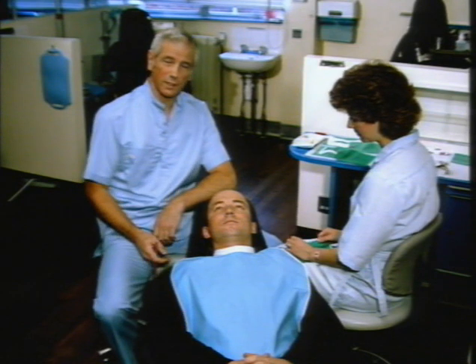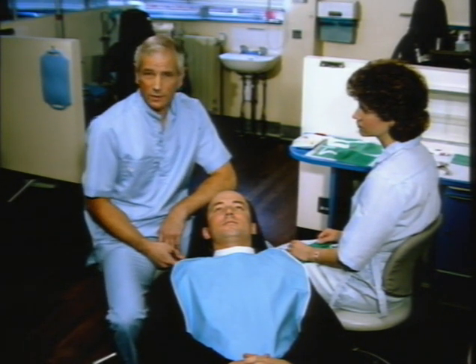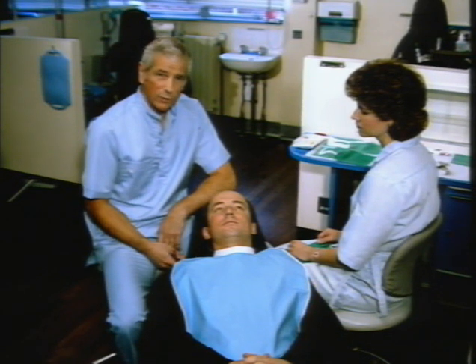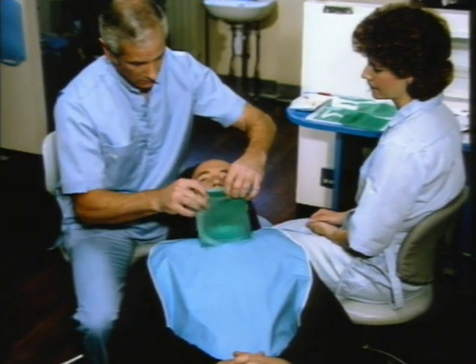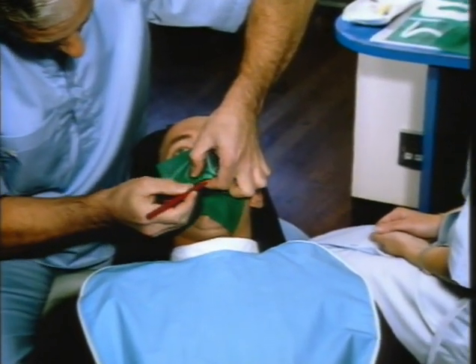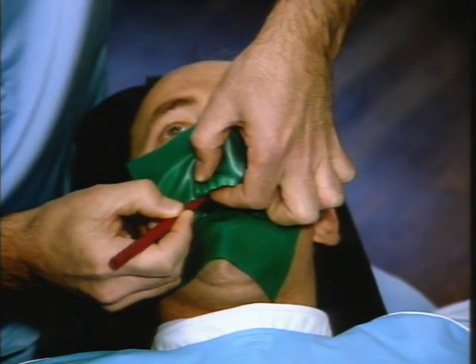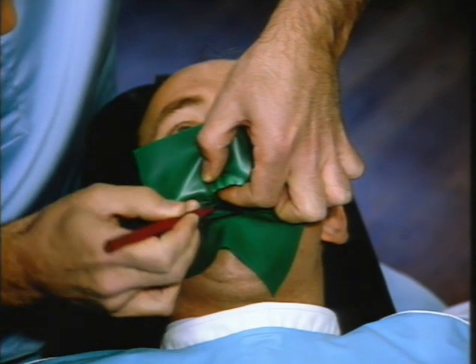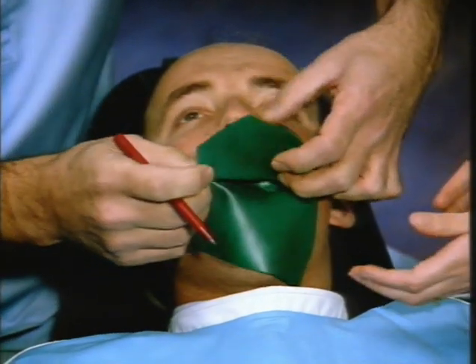Right, let's look first at the individual tooth positions, because obviously they're determined by where the actual teeth themselves are in the mouth. The simple way of recording this is to take a blank piece of dam, place it in the correct position on the patient's mouth, and then using a pen to mark the tooth centers, just do that, like that. I won't go too far back in the arch, just enough to let you see exactly where those centers will lie.